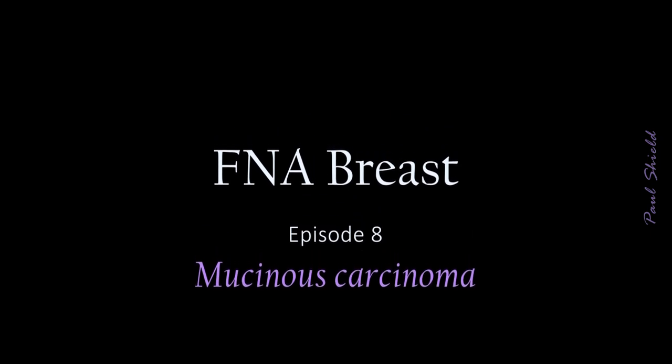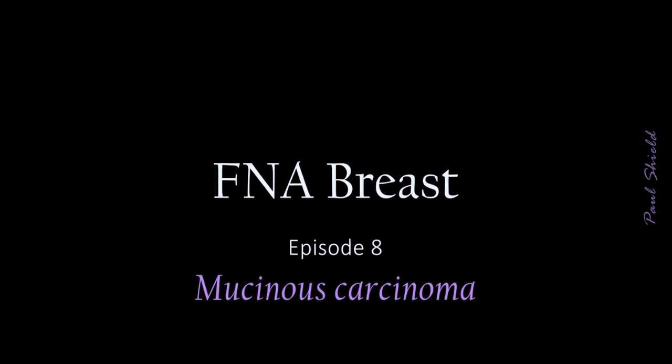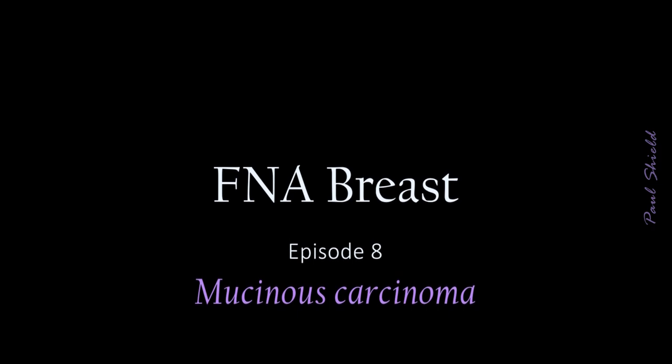Hi, it's Paul. I just want to look at a couple of cases of mucinous carcinoma. This is an uncommon variant of ductal carcinoma of breast, usually seen in a mixed pattern, but it does have some distinctive features, and it illustrates how sometimes the common pattern I've shown you of malignancy has some variations.